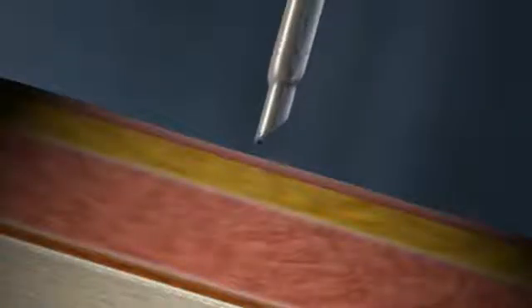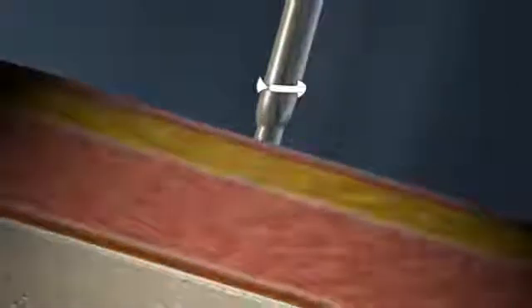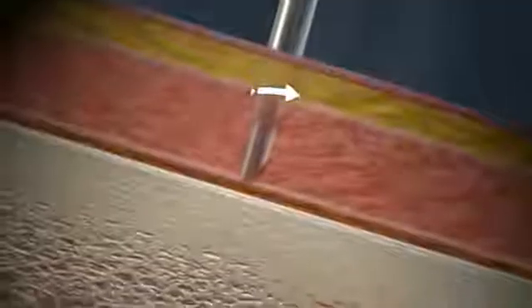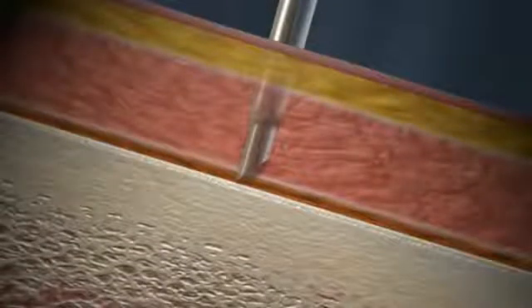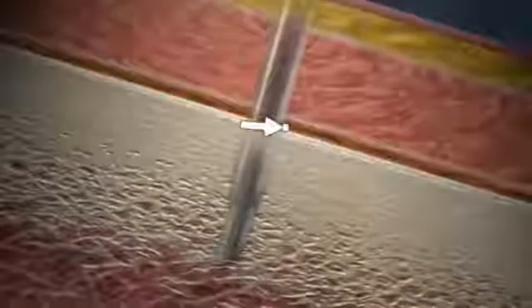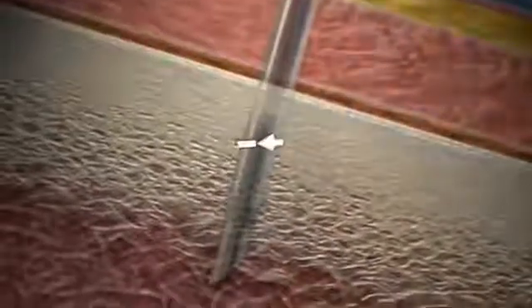Here's how it works. Introduce the Jamshidi bone marrow biopsy needle as you normally would, with firm pressure and an alternating clockwise-counterclockwise motion. The razor-sharp bevel tip enables the needle to quickly and easily penetrate the cortical bone.